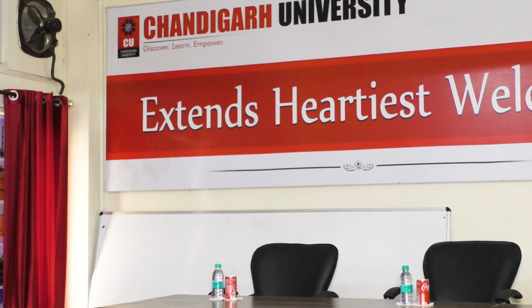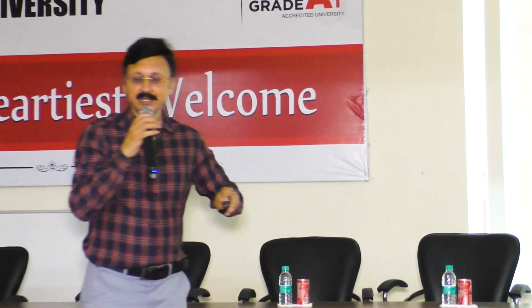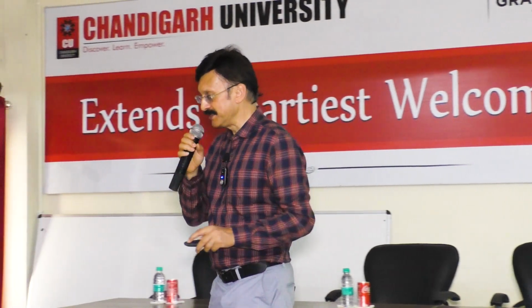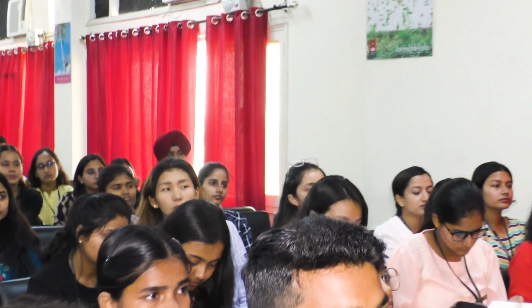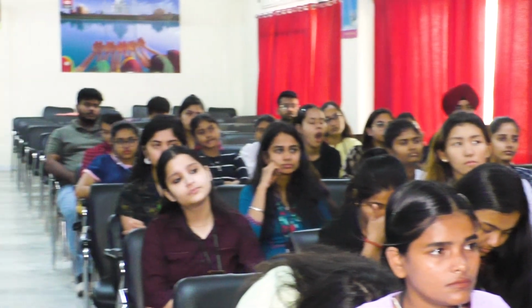So here you can see, first before we discuss about the ECG, can anybody tell me what is an ECG? So it is basically a record of the electrical activity of the heart. So our heart has an electrical activity. So how the electrical activity goes on? Anybody knows that? Or should I tell?